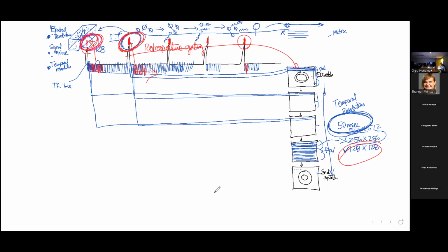Okay, we can coordinate the image acquisition, the pieces of information, and orient them relative to the QRS complex, or a constant signal. And we can use retrospective gating, and go back and do this in time, and we can make these beautiful cine movies.